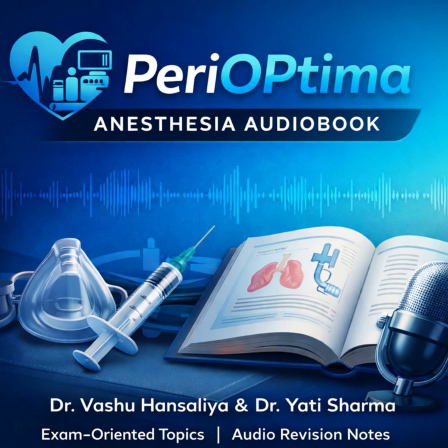Let's focus on the crucial numbers that examiners love. The airway seal pressure. This is the hard limit. You must know this trio perfectly. This hierarchy directly determines the clinical utility. The classic LMA seal pressure, typically 20 centimeter H2O. That's the baseline. The ProSeal LMA seal pressure, approximately 30 centimeter H2O. A significant step up. And the LMA Supreme seal pressure, the highest, up to 37 centimeter H2O.